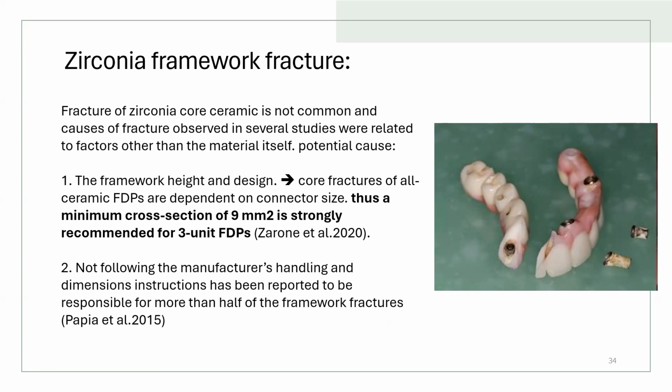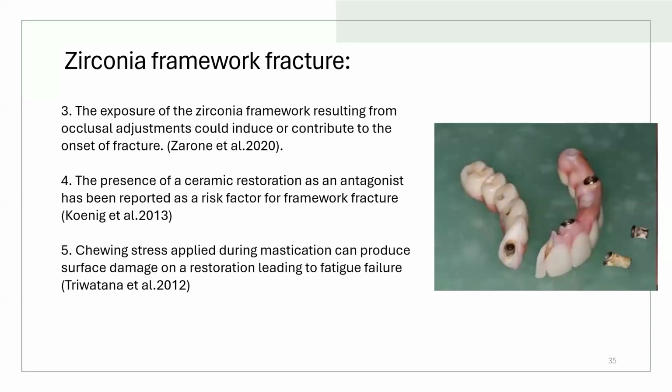Okay. The other reason is not following the manufacturer's instructions in handling and dimensions. It has been reported that this is responsible for more than half of the framework fractures, when the technician or the clinician do not stick to the instructions of the manufacturer regarding thickness and handling of the material. Another potential cause is the exposure of the zirconia framework resulting from occlusal adjustments in the clinic. This can induce or contribute to the onset of fracture.